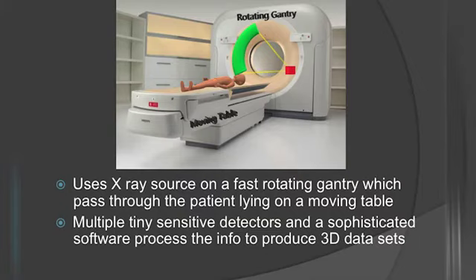So the gantry is composed of an X-ray source, which I've just marked here as an X, for example, which showers these X-rays at precise intervals in the form of a cone beam. And that falls on this array of detectors, and they are very sensitive detectors. So the patient moves inside at a constant speed, and this X-ray source with the detectors moves around the patient, sending out beams at constant intervals.